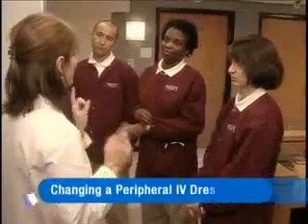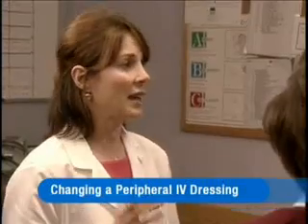Okay, I'm getting ready to go with Jeannie to do an IV dressing change, and I thought we should just check in really quick about this process because IV sites are a potential entry point for microorganisms into the bloodstream. That's why we use sealed IV dressings, right? That's right. We do that to prevent complications. When these dressings need to be changed, it's important to observe meticulous technique to minimize the possibility of contamination.